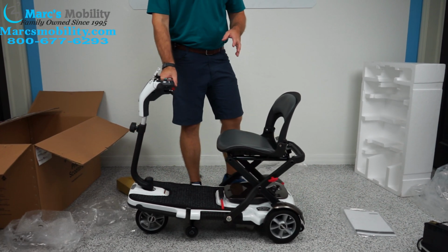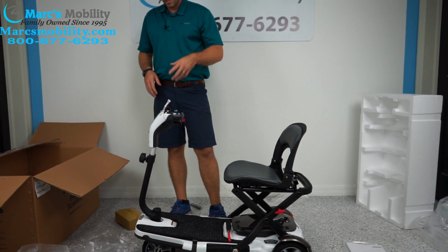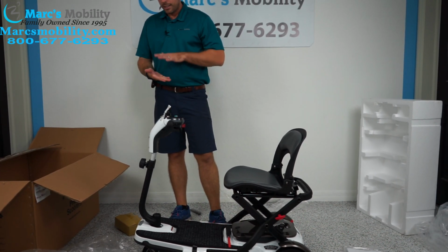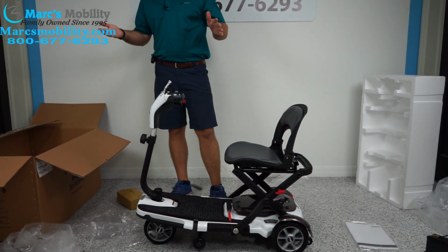This is a very simple setup, literally just, it's pretty much fully assembled. The only thing you have to do, put the key in, lift the battery pack up, and slide out the little plastic that they have that's blocking the connector from making a connection, and then you're ready to go.